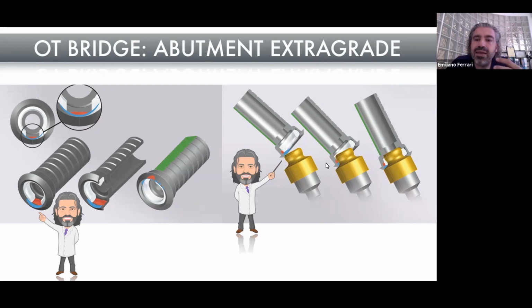Those wider areas allow you to insert those abutments also when you have some divergence, as you can see in the picture. We will show you some pictures, some videos, some clinical cases to explain this concept, but the secret is all here. This wider area allows you to insert your rehabilitation following the insertion axis that you have chosen, also if you have some divergent implants, respecting this insertion area.